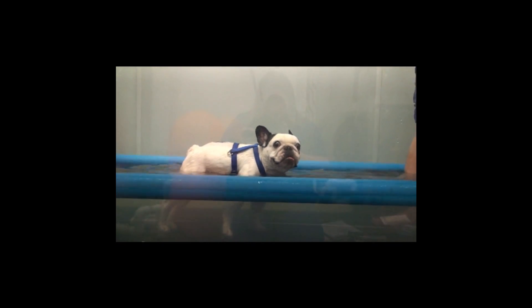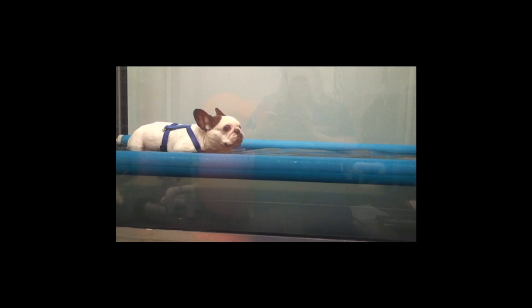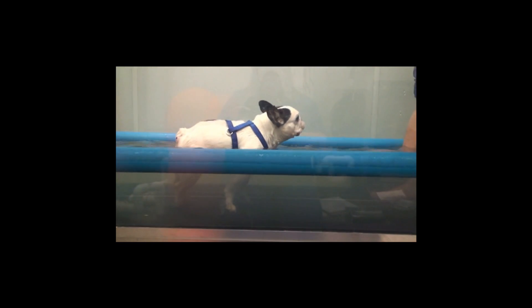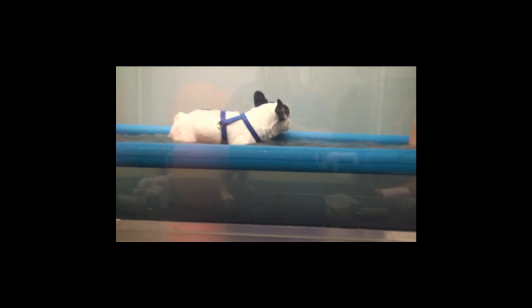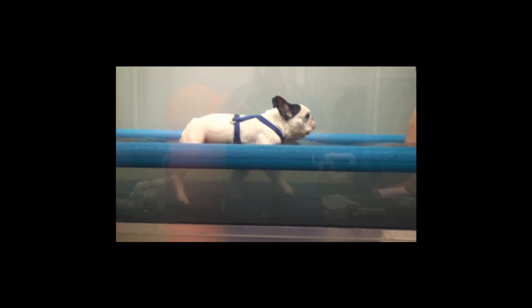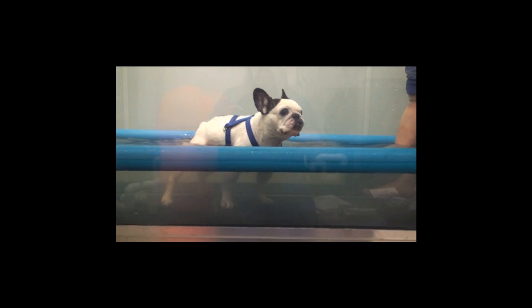Good girl. Water-assisted movements, but that's what we want — we want to train her to use her legs. The treadmill helps to simulate ambulation and promote ambulation. Doing really well.